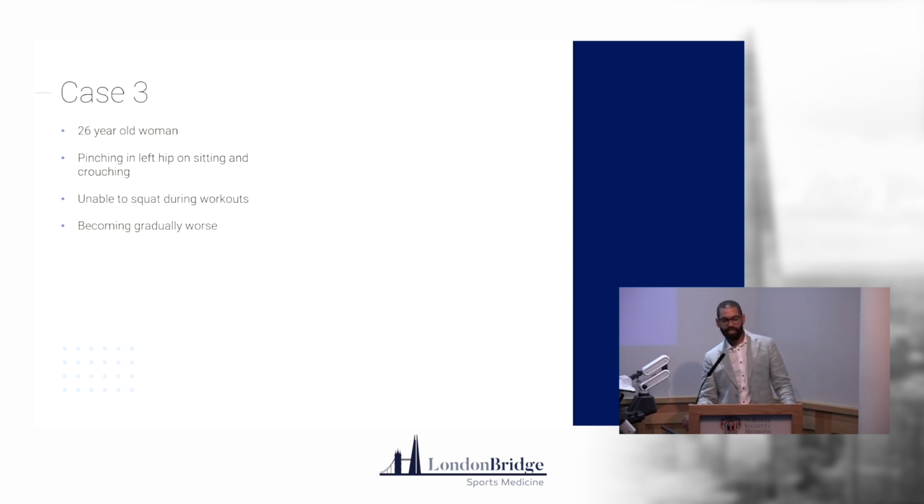A 26-year-old, pinching in the left hip on sitting and crouching, unable to squat during workouts. Very upset by that, can't do her Barry's boot camp. Gradually becoming worse. What would you do? Hands up for ultrasound. What are you expected to see on the ultrasound?